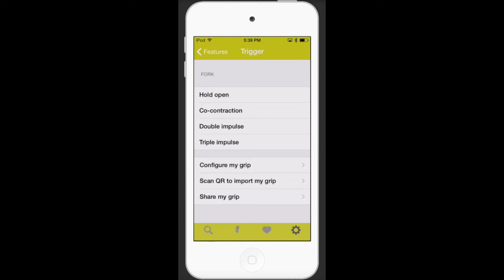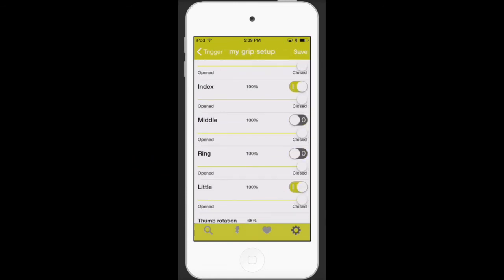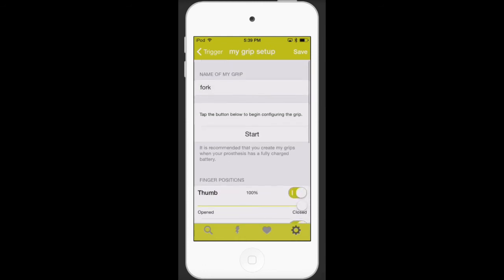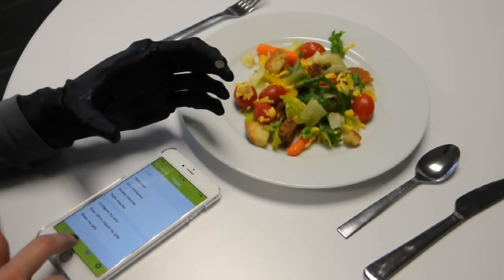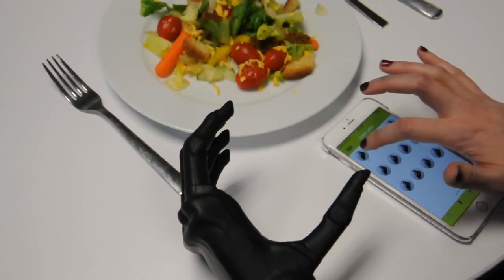Another option after programming a MyGrip is to configure it so that certain fingers are inactive during that MyGrip. Doing so provides an extra level of customization and can improve performance of tasks like the example shown. You can activate a programmed MyGrip by selecting the lightning bolt icon to instantly put the hand in the MyGrip of your choice.